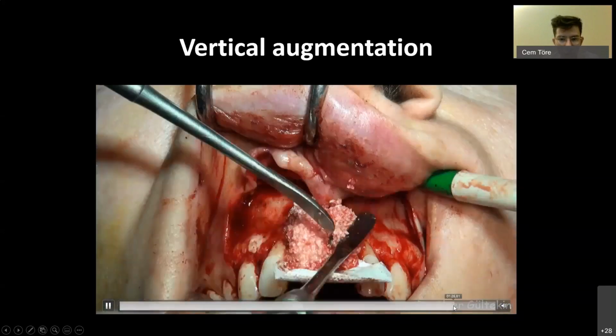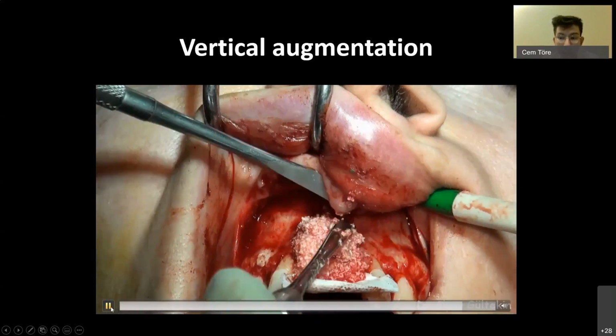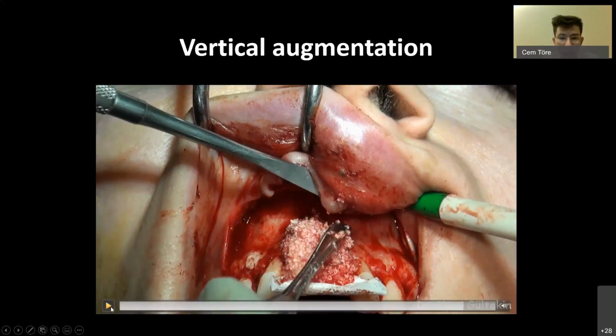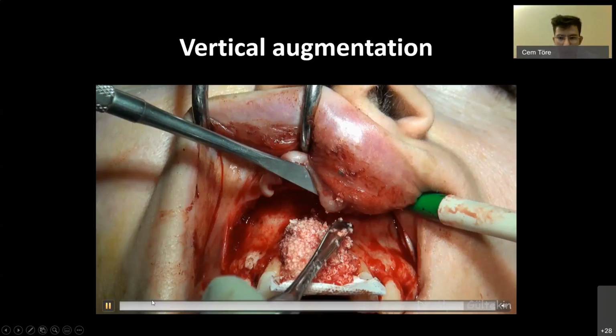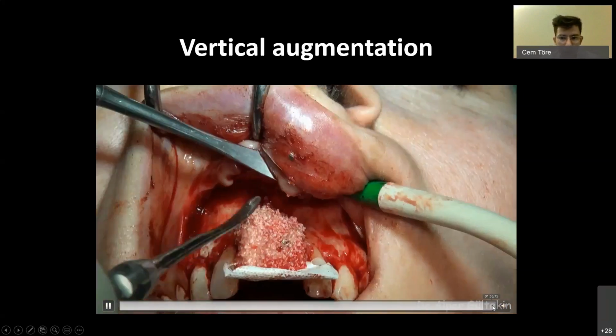Once we are happy with the bone's shape, and we have to be happy, mind you, with the bone shape, because the PTFE membrane cannot be stretched over the parts we have missed. So you want to first roughly shape your bone graft in the area, and then fold it over, screw and pin, both in the corners and the midsections of the angles to hold it in place.